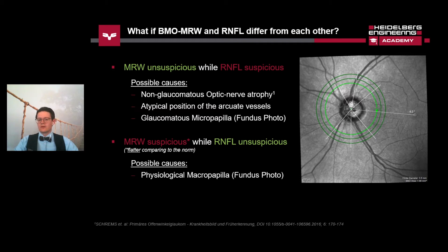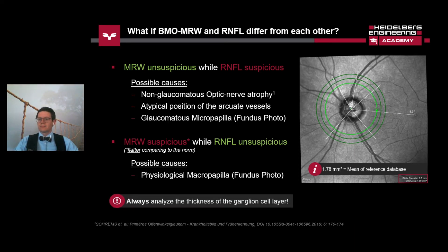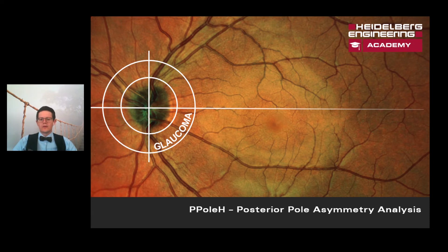As an important reference value, the mean of the reference database for the Bruch's membrane opening center is 1.78 square millimeters, and you can always see the Bruch's membrane area at the bottom right in your infrared image. If you have suspicious and unsuspicious values that you cannot reconcile, it is always important to analyze the thickness of the ganglion cell layer. Let's take a step away from the optic nerve head and see what we can analyze around the macula using the posterior pole scan.